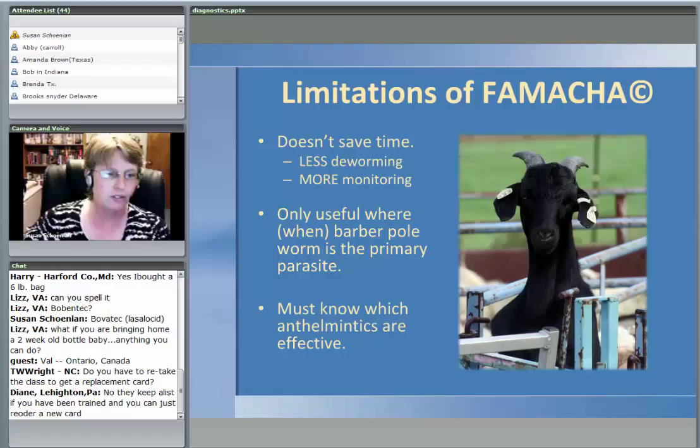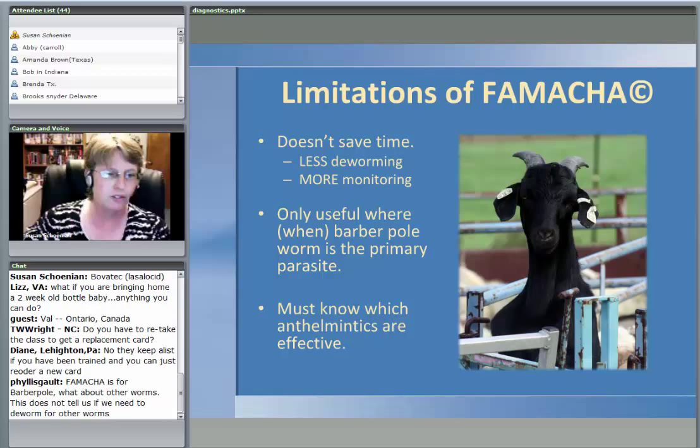The other thing is, and I think most of you realize this, the Famacha system is only useful where barber pole worm is the primary parasite. Now, the good thing is, I think for most of you participating in this webinar, it's the primary parasite. If you don't have a problem year-round, which most of us don't, it's the primary parasite during the summer when parasites are the biggest problem. It does not tell you if you need to deworm for other worms, no. But keep in mind, the barber pole worm is the most common parasite. The barber pole worm is the most pathogenic parasite. It's the one that produces the most eggs. It's the one that's the deadliest. If you recall from one of my earlier slides, I think I showed you the percentage of barber pole worm in our goat test. Always over 80%, very frequently over 90% of the worms are the barber pole worm.